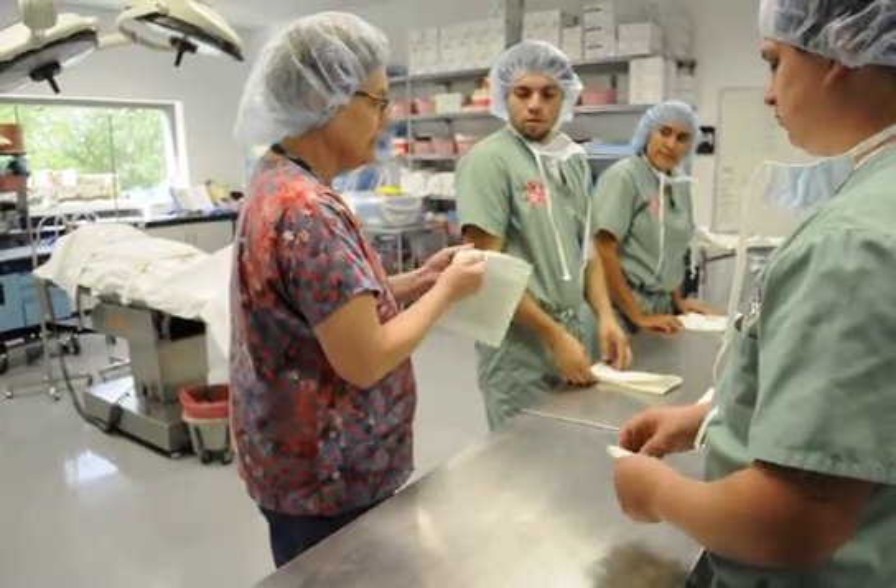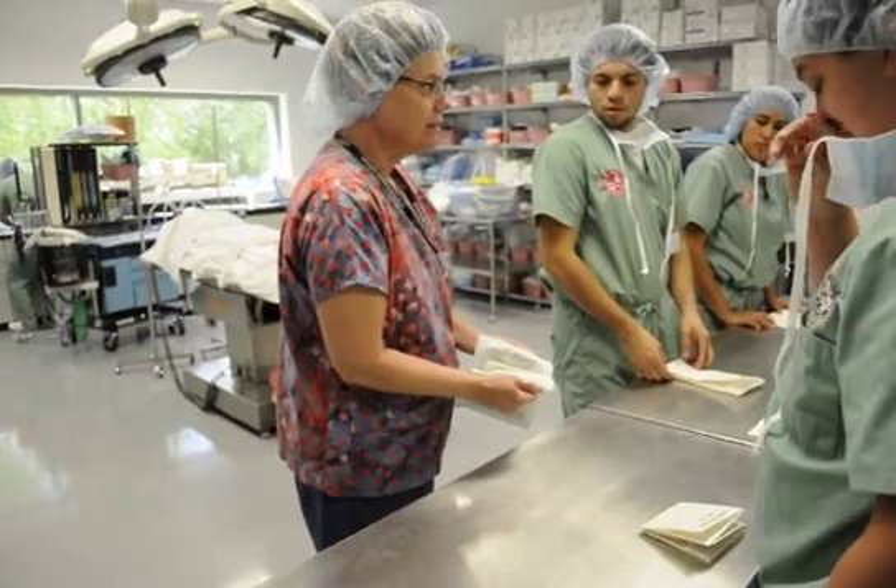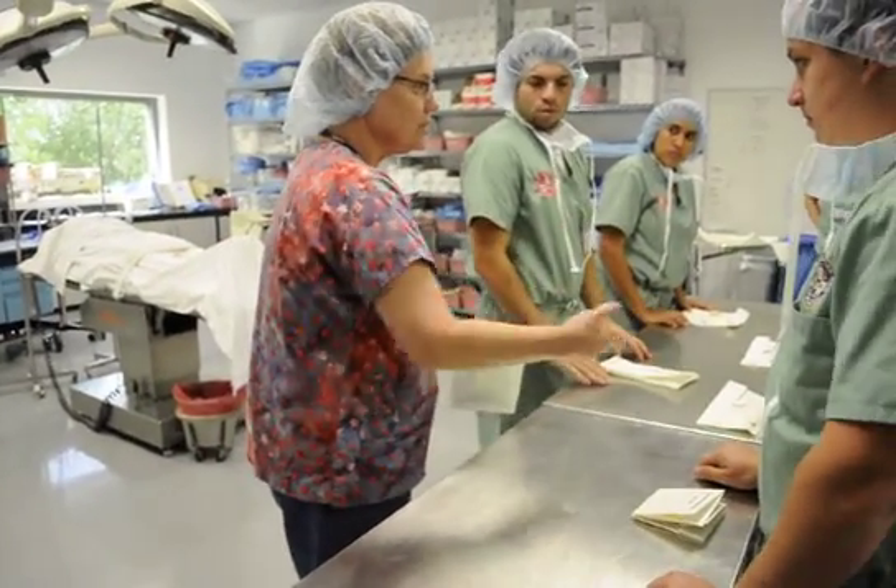It's going to be a sterile package, so you can open it. You don't need to eject it, unless you're going to put it on a sterile field.